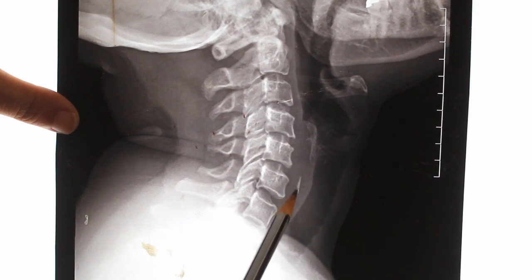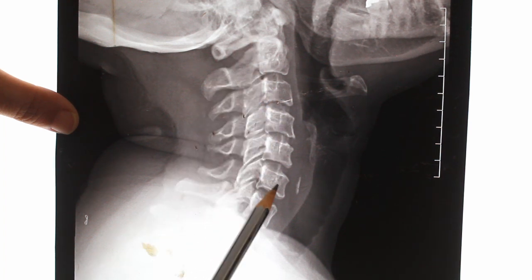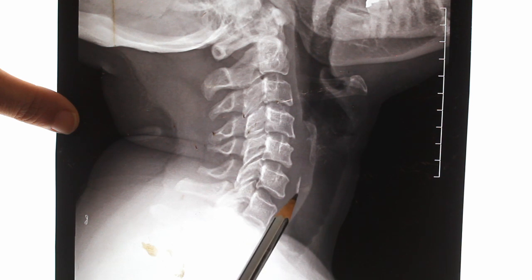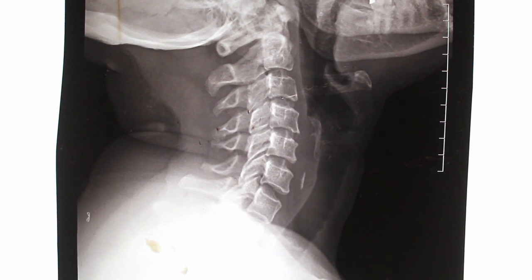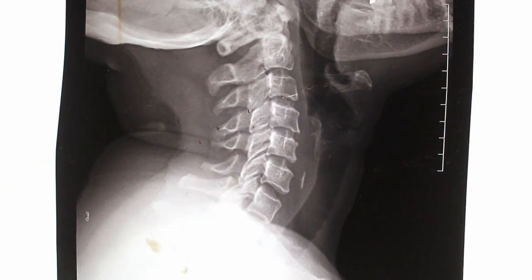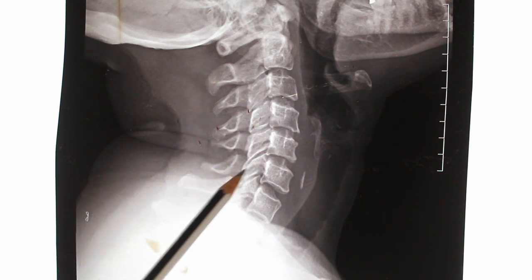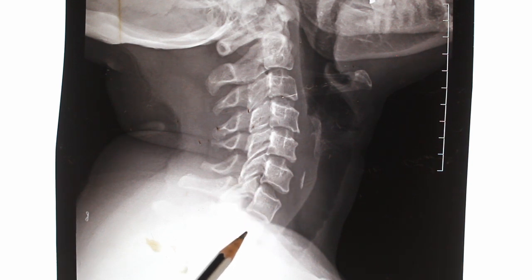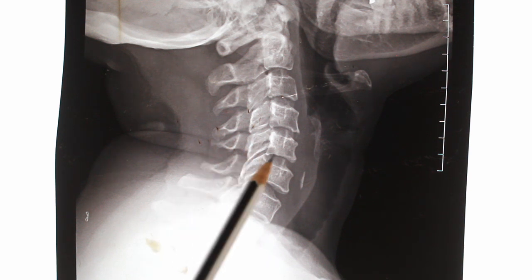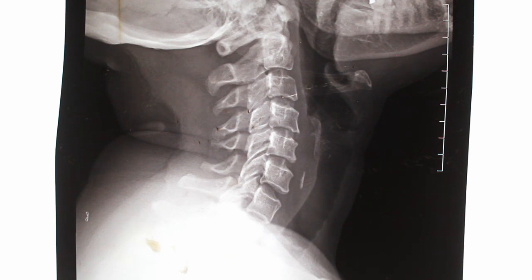Here you can see a linear radiopaque foreign body in the retropharyngeal space opposite to C6 vertebra. This is most probably a fish bone. Treatment is removal using foreign body removal forceps in hypopharyngoscopy or esophagoscopy — ideally under general anesthesia. If the patient is cooperative and general anesthesia is not available, local anesthesia can be used. If not removed, there is a chance of the foreign body penetrating or migrating into other areas.